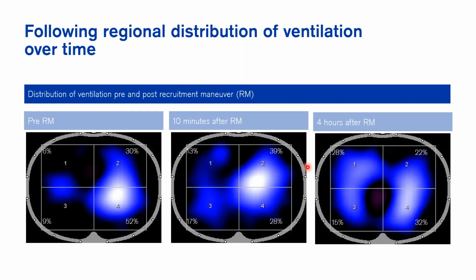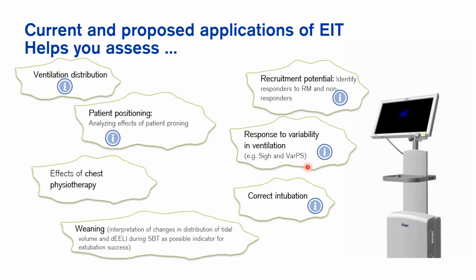So basically, we can do it continuously, at the bedside, and non-invasively. So let's have a look at what EIT is good for. What can it be used for?